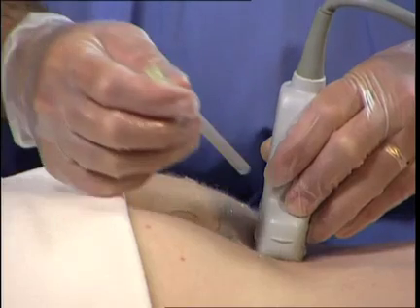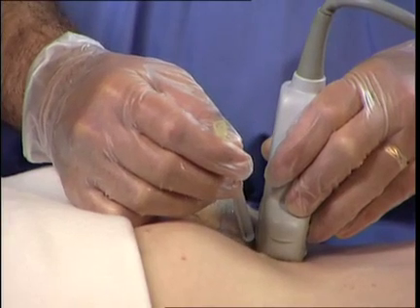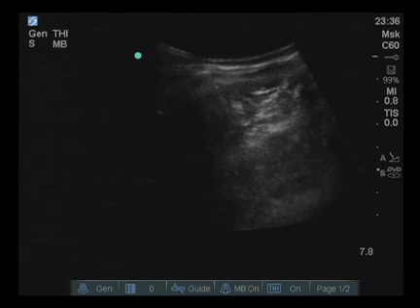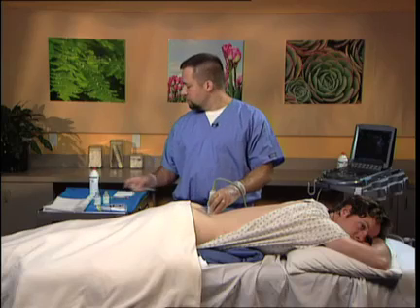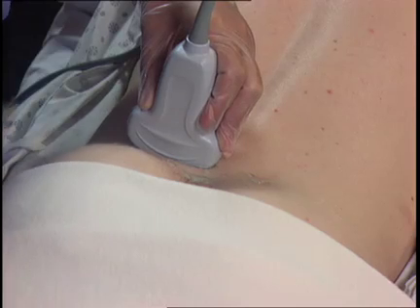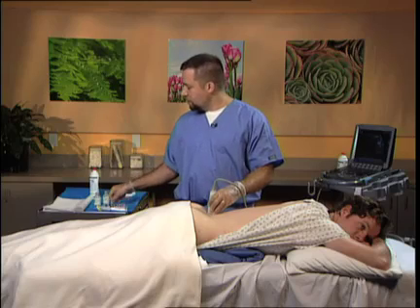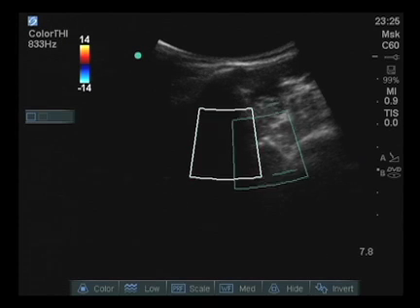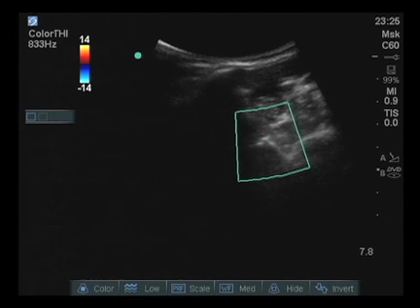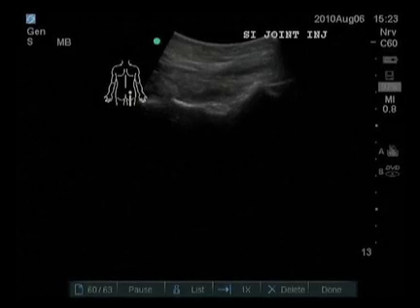Then I'll utilize the 3.5-inch spinal needle, 25-gauge, and enter that track that I have placed local anesthetic within. The needle tip will then be placed within that joint identified in the center of the screen right here. At this point, I attach my syringe containing the local anesthetic, steroid, and saline mix. And then I can utilize color flow Doppler to actually visualize perturbations of the liquid as it enters the joint. The view is in the short axis, therefore the needle is not visible.